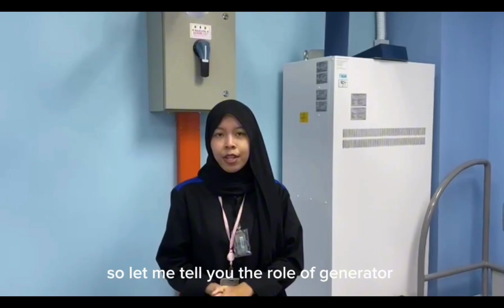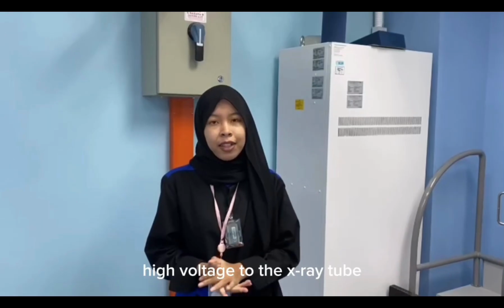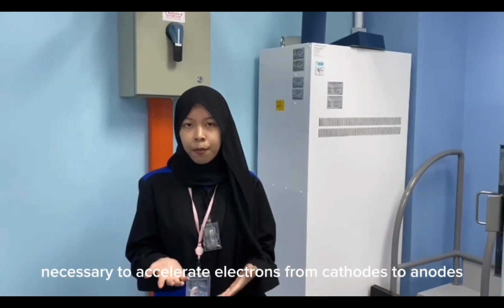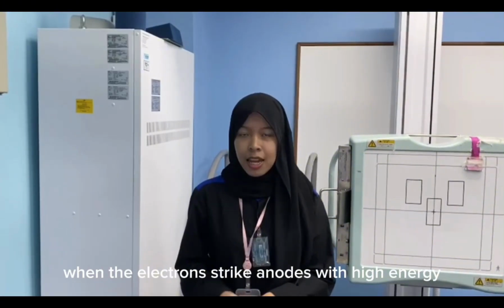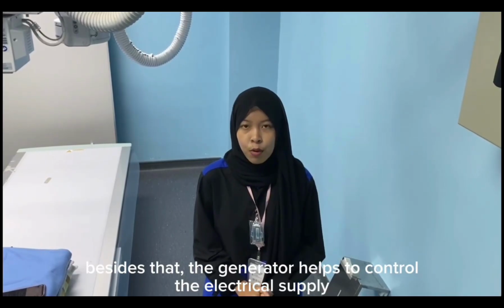So, let me tell you the role of the generator. The main role of the generator is to provide high voltage to the X-ray tube. This high voltage is necessary to accelerate electrons from cathode to anode inside the X-ray tube. When the electrons hit the anode with high energy, X-rays are produced. Therefore, the generator is essential for the production of X-rays. Besides that, the generator helps to control the electrical supply and provide consistent X-ray output.